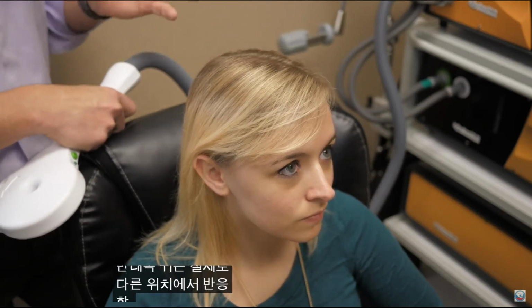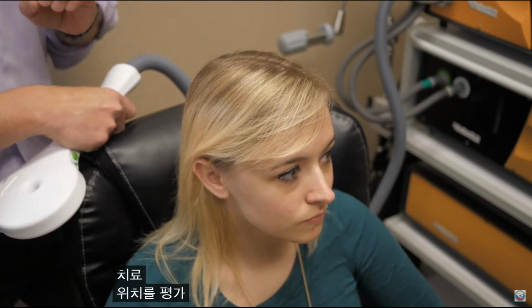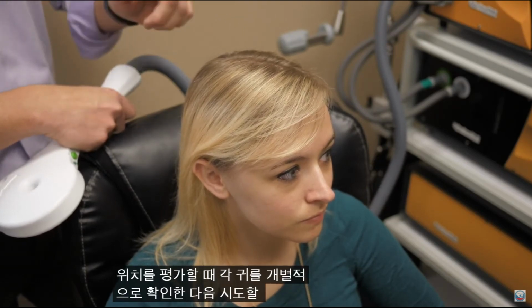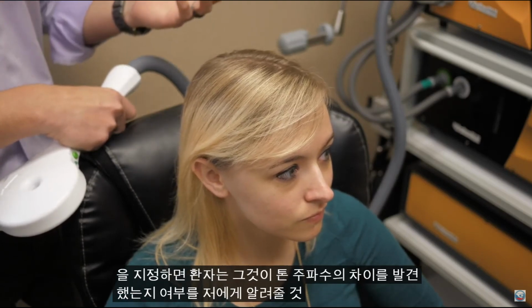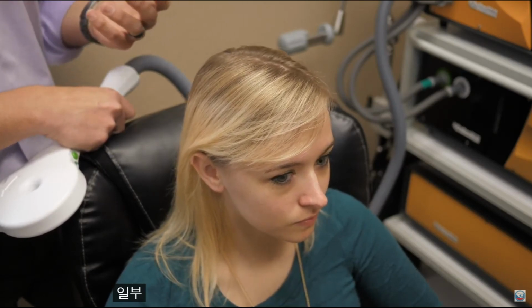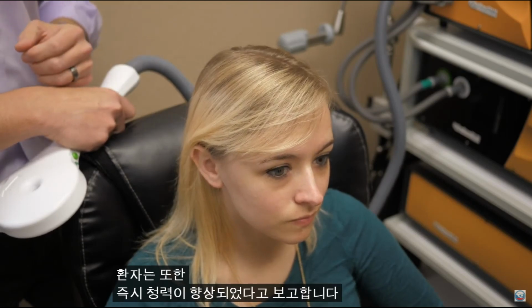And so that's something that you've got to look at. So when I am assessing for treatment location, I look at each ear individually and then I can try to target by just doing a couple of test locations, and then the patient will let me know whether that's been something that they've noticed a difference in the tones, the frequencies, the volume, and some patients will also report that they immediately have improved hearing too.